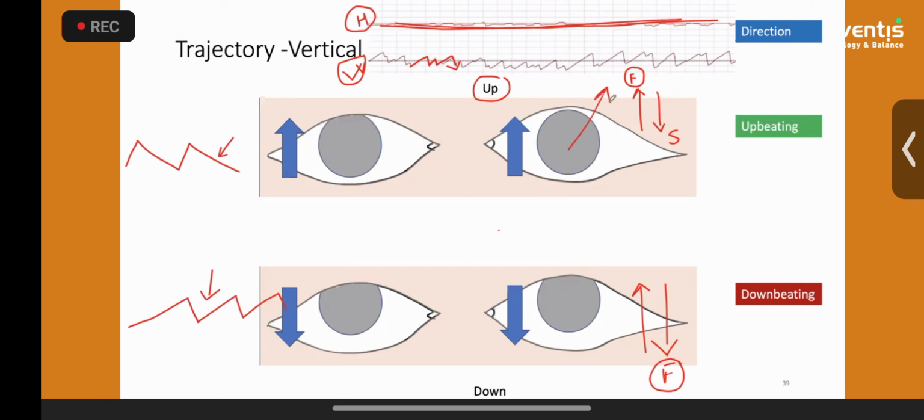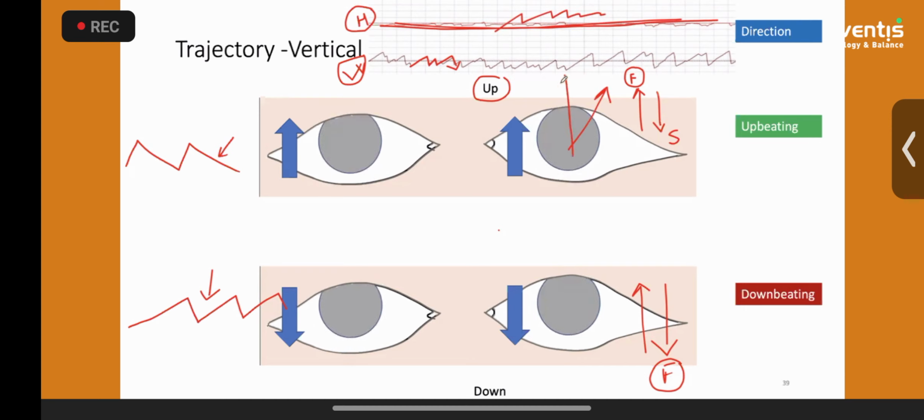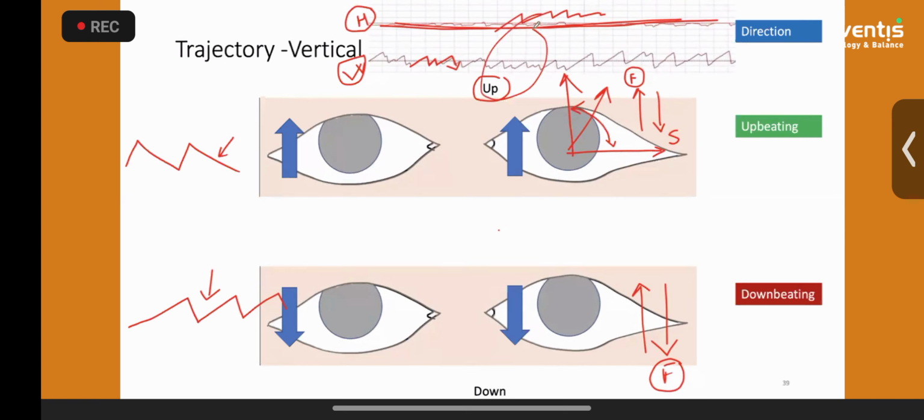If a person has oblique nystagmus, even his trace will show some nystagmus. If it is a pure vertical, it will clearly show only in the recording of vertical. If it is a horizontal nystagmus, it will show only in the horizontal tracing. If it is oblique nystagmus, anywhere in between this, then both the graphs will show some movement, like the nystagmus, depending on which side is more. Like, is it more predominantly vertical versus horizontal?